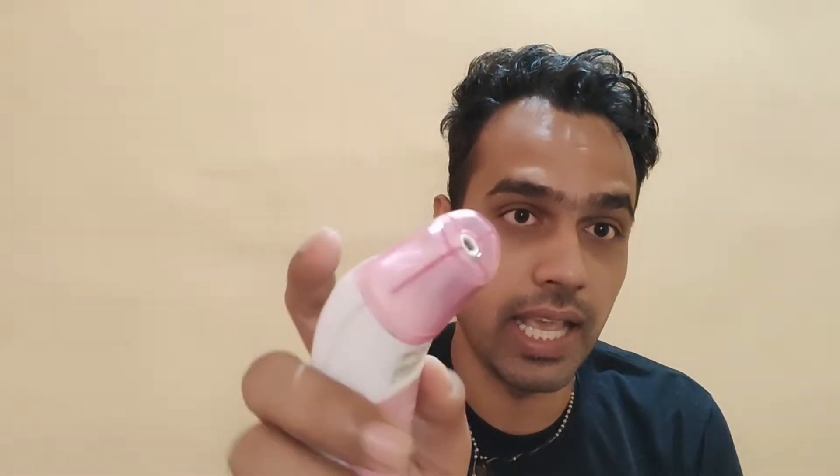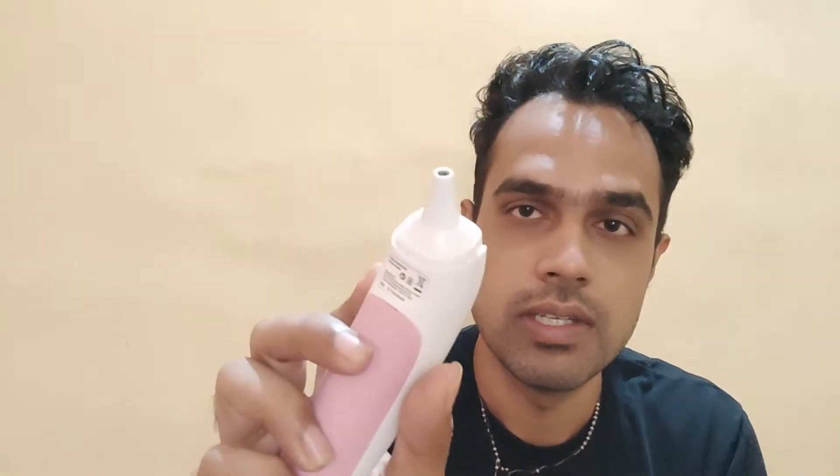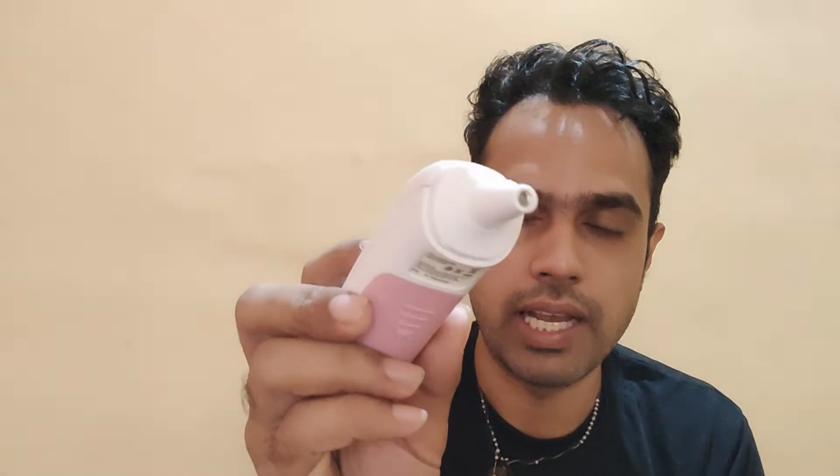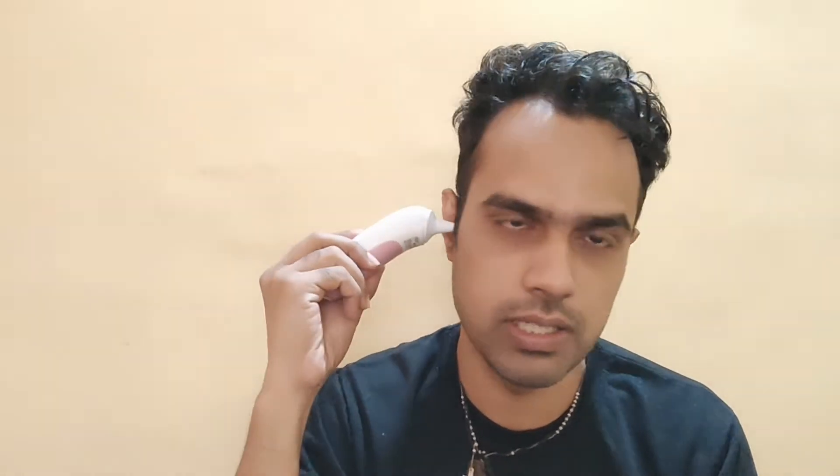One is the infrared forehead mode — with the cap on, you press the F1 key and it takes temperature in forehead mode. If you want to check temperature in the ear, you remove the cap; here's the thermometer's checking point. You put it in the ear and press F2 to get a reading. So F1 is for forehead mode and F2 is for ear mode.